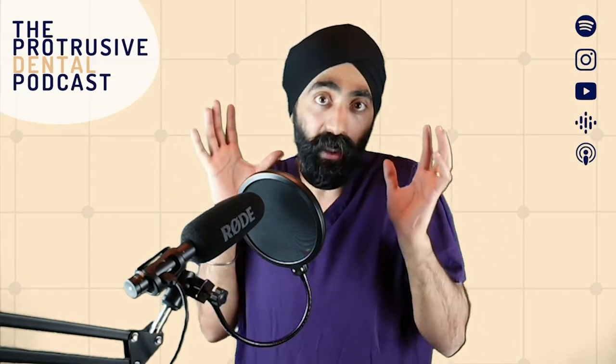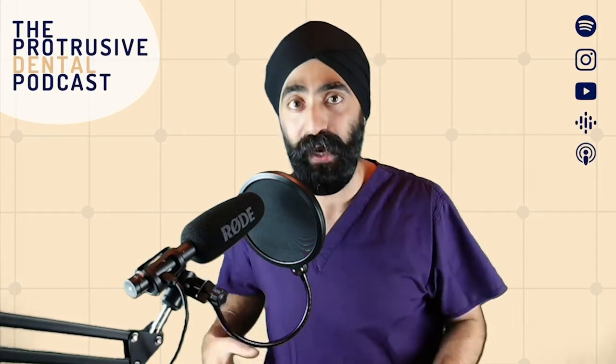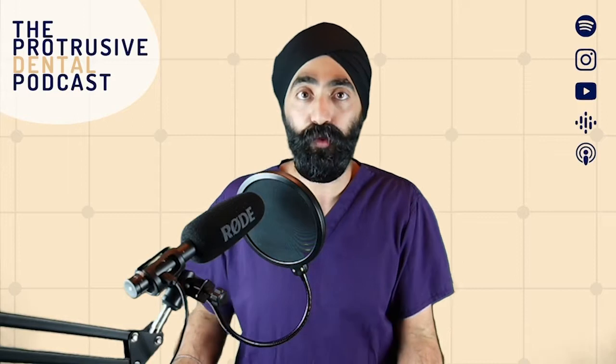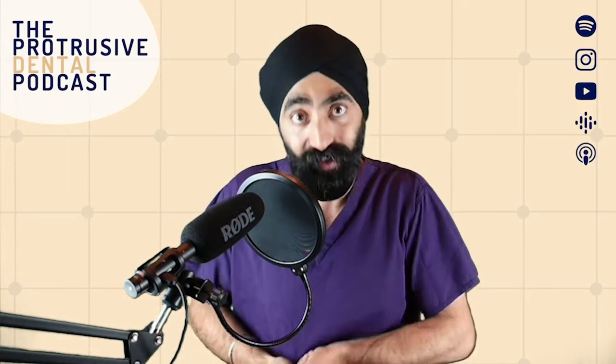So essentially, the best articulator in the world, should it ever be designed, would have the exact same movements as the patient. So it's like recreating the patient's jaw movements, but outside the mouth. So one such tool is a Facebow, and that is exactly what this episode is about.